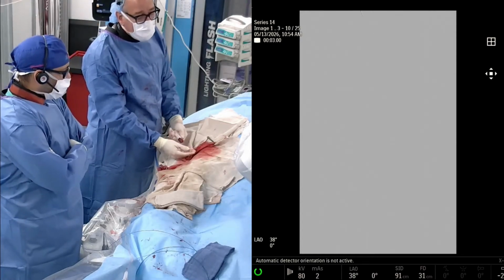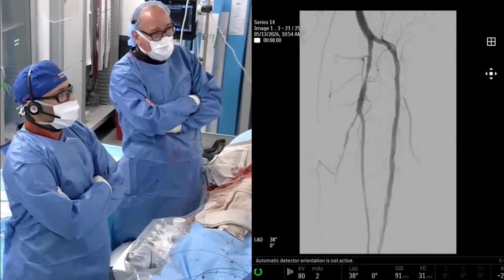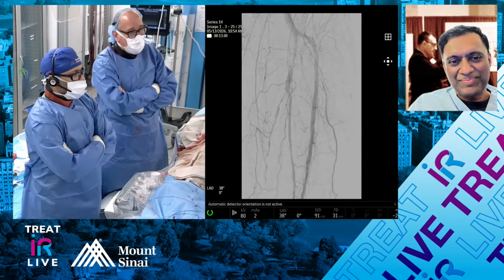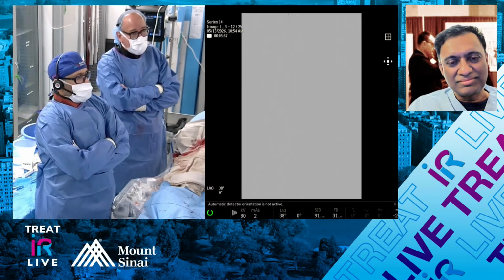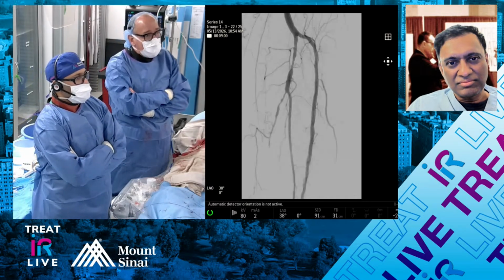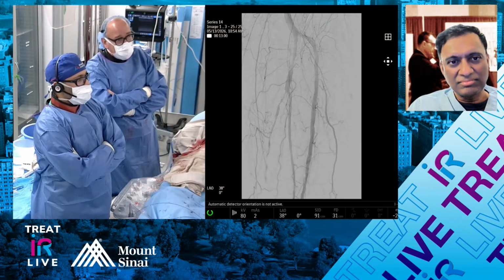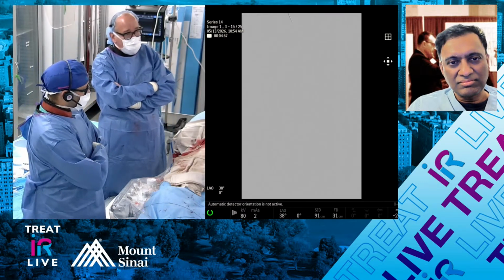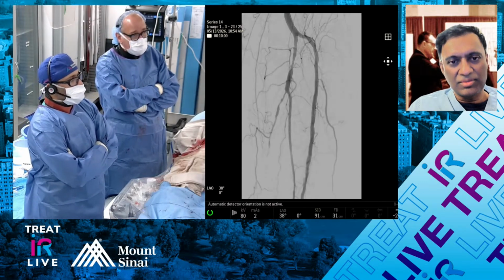All right, we're at time at the hour, Joji. I know you have obligations, and I appreciate you joining us here. I think we're able to demonstrate how valuable IVUS is in terms of sizing not only your vessel prep platform, but perhaps your IVL strategy, and then using it to measure the size of these scaffolds. I think we have a really nice result here for this patient. We may very well, off camera, optimize the tibial peroneal trunks. I do think that's going to lead to this patient having a more durable result afterwards.